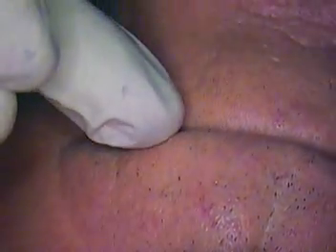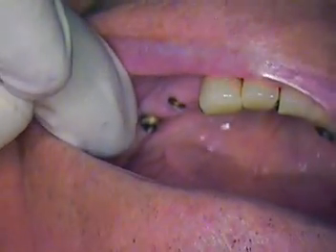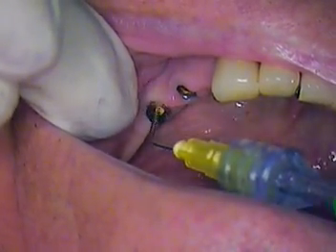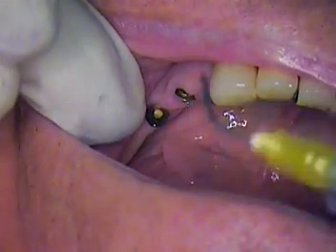Let's put together our IMC in the wrench. It's very simple — bottom that out, tighten, tighten, tighten. And now we're going to go ahead and dry out the mouth.